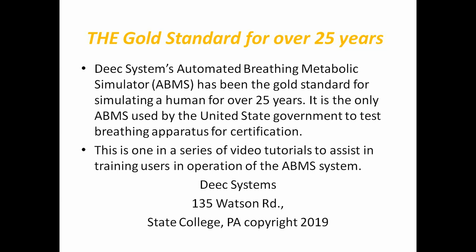Deec Systems ABMS is the gold standard for human simulation after over 25 years of qualification testing and refinement. The Deec Systems ABMS provides the most accurate and detailed simulation of a human available today. The federal government uses the Deec Systems ABMS as a critical tool for testing breathing apparatus submitted for certification by commercial manufacturers. Now let's get started exploring an amazing system, the Deec Systems ABMS.